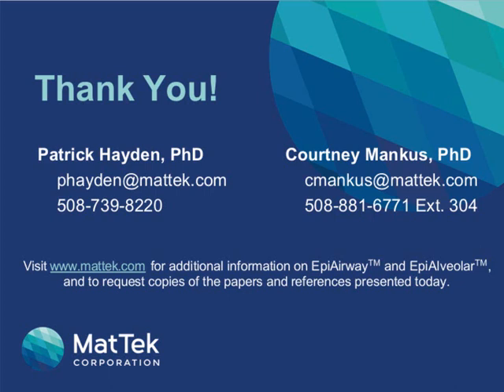They published a patent application for predicting airway toxicity in EpiAirway. So what we recommend for people when trying to do toxicity studies is to always use a benchmark chemical, something that they know well in their own hands. This is irritating in vitro or in vivo or not, and then they can benchmark their new formulations against that. So I think that tends to work well for people.